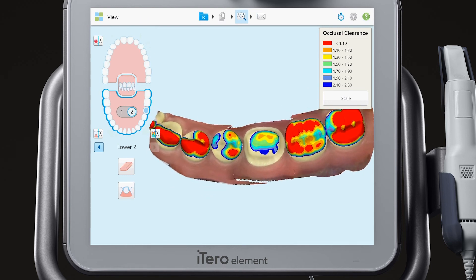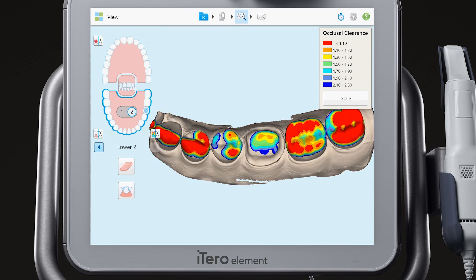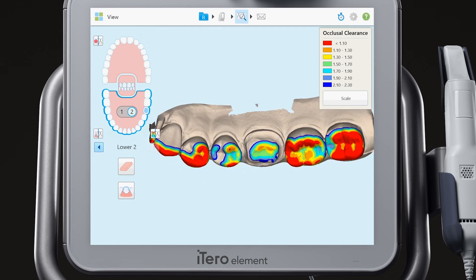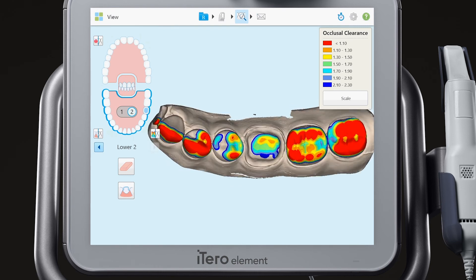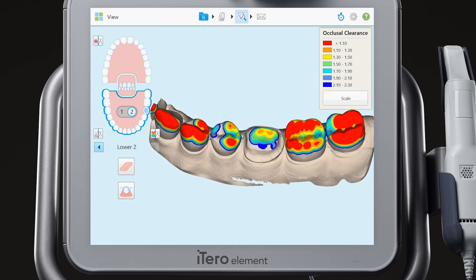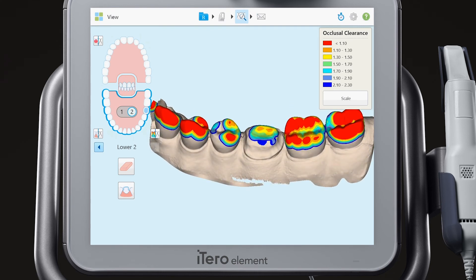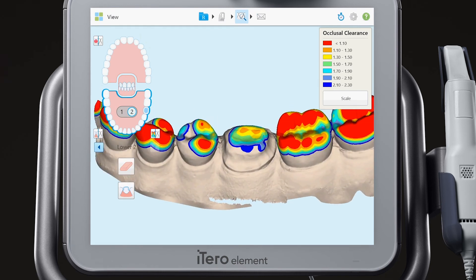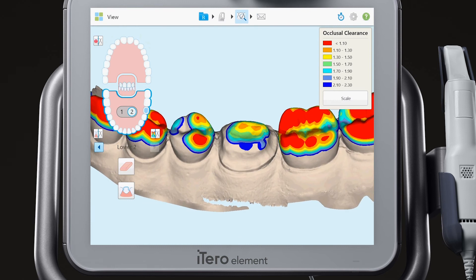Turn off the color to observe additional detail in the digital model. You can also zoom the model to observe more detail.